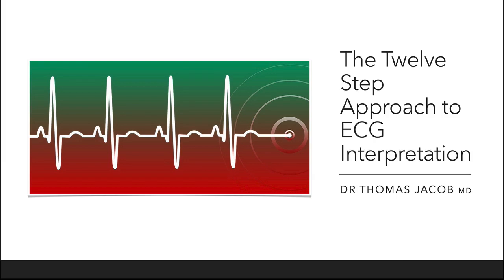So let's get started. As we head into the 12-step approach to ECG interpretation, I would just like to tell you that I won't be covering the basics, and I've put the links below to the previous 4 levels. And if you'd like to go deeper into the basics at any stage, you could access those ECG tutorials below.